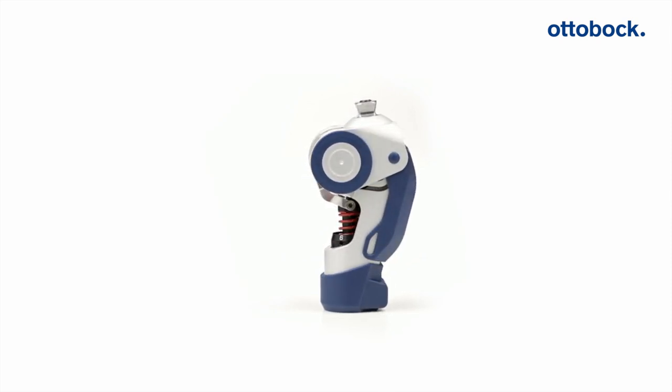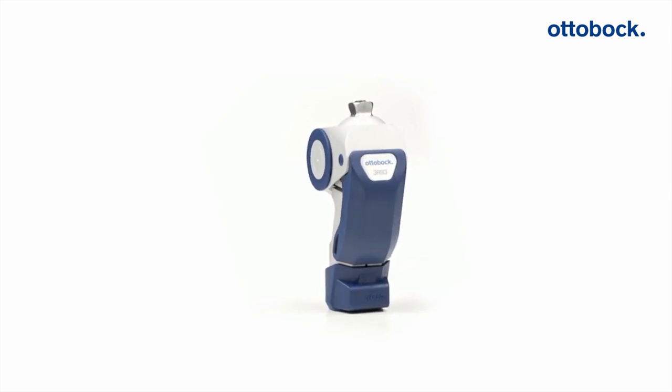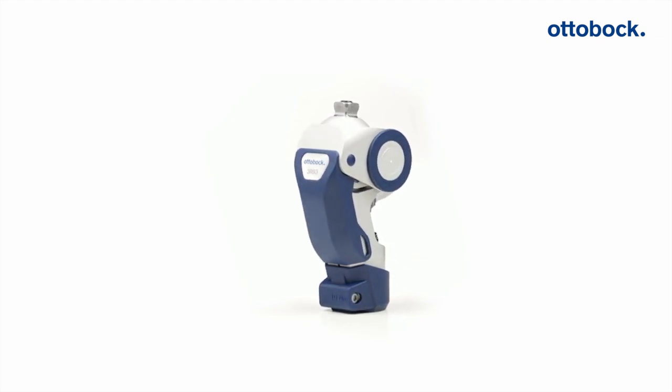The locking function is permanently activated when the prosthesis is delivered. Like conventional locking knee joints, it can be manually released with the pull cable when the user sits down.